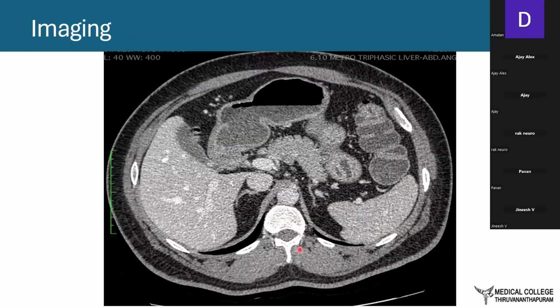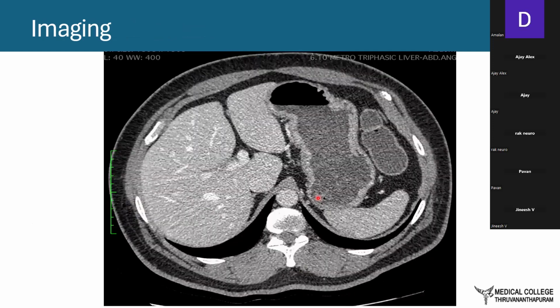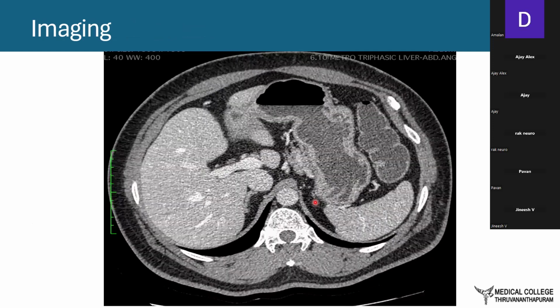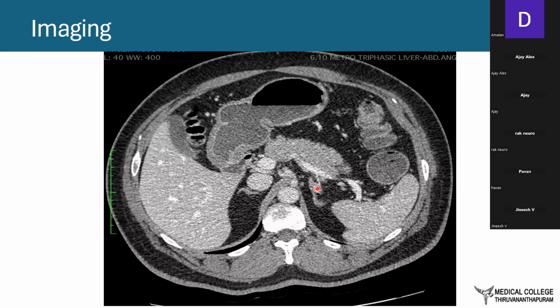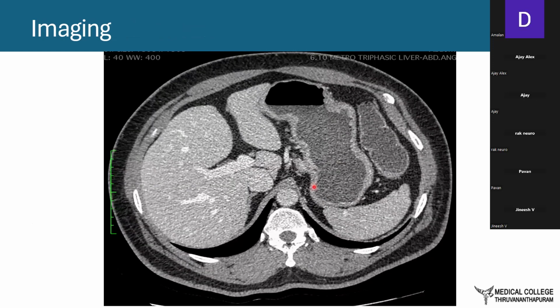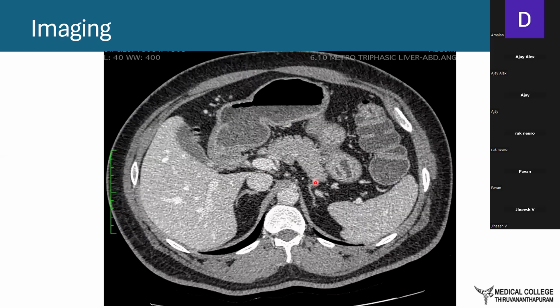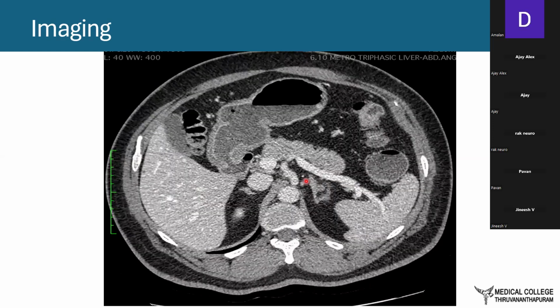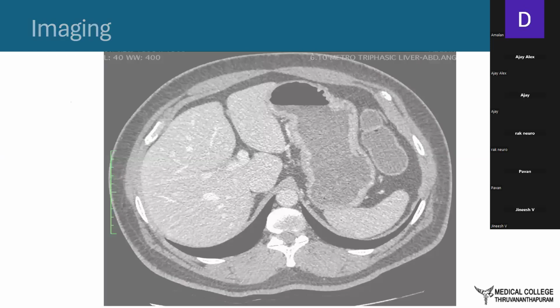So this was the initial CT venous phase that shows the small adenoma thickening in the left adrenal gland. What we generally plan on doing is basically trace the adrenal vein. This is the location of the left adrenal vein that starts from the body and then joins into the left renal vein. This was the right adrenal gland that was normal.